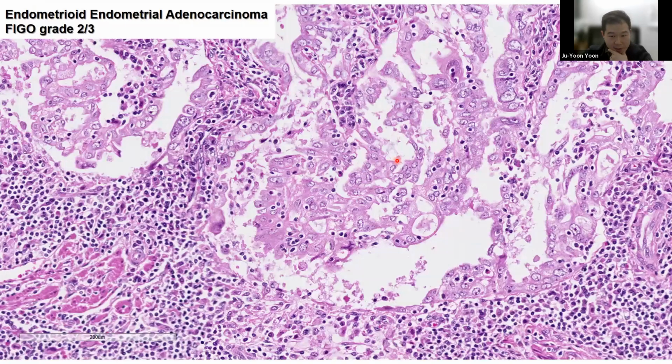But when I look at the carcinoma, this is one of the things where, if I had a gynae colleague, I'd say, wink, wink, hint, hint, a lot of immune cells, fairly significant cytologic atypia. You can see that some of the lesional cells are probably around 20 microns, that's maybe around 10 microns, and then here we have what, 40 microns. So highly significant nuclear pleomorphism.